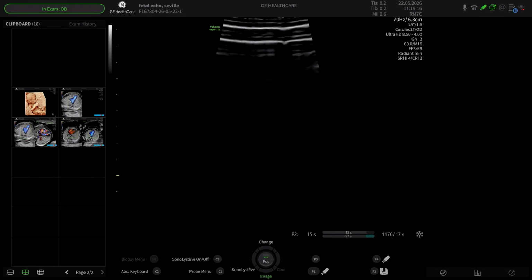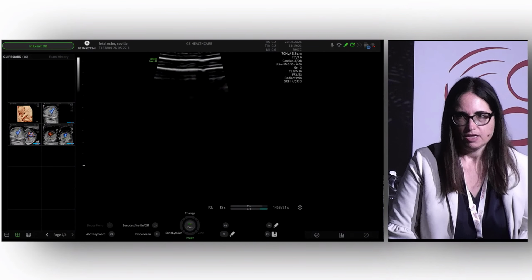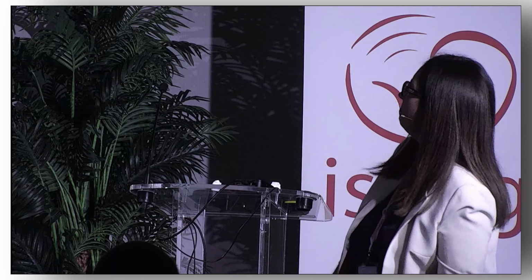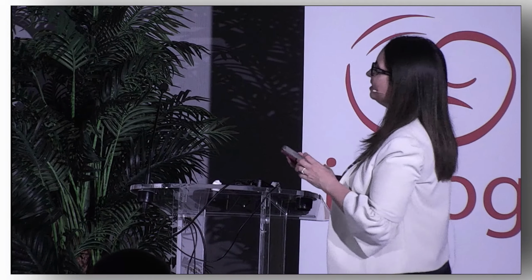Okay. In the meantime, is there any question or comment? Yeah, and in the app, yeah. Yeah, Simon, I might say to you that it has been impressive how fast you have been able to get these super nice images. And I think that it's very important to get used to always trying to improve the settings. Yeah, because I think you do it without thinking about it, but it's important.